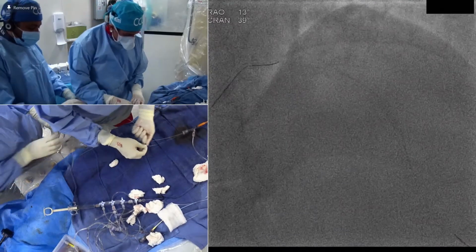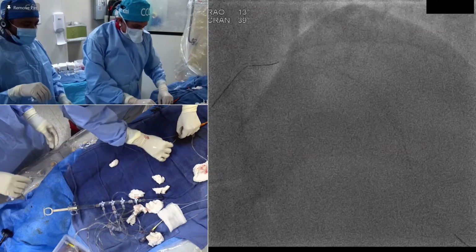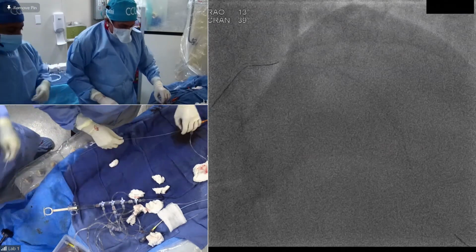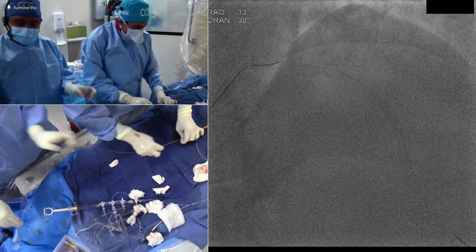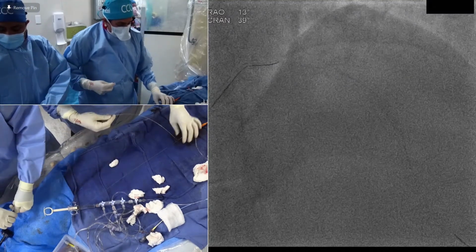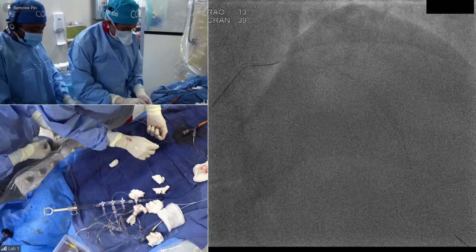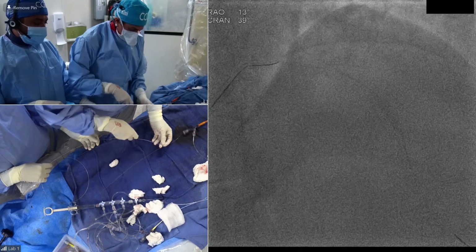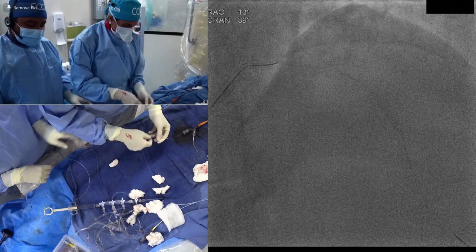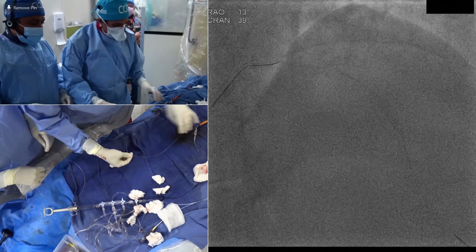And of course, Dr. Kini is going to have to recross this diagonal. Right now, remember, for the DK crush, we have to recross, we have to kiss. We are not doing that step. Instead, I'll place the stent in the LAD, recross, and then kiss. I understand, but that is the very difference. You have recrossed this diagonal, if not 5, for sure 4 times already. So it's going to definitely happen even with a crushed stent in front of it.